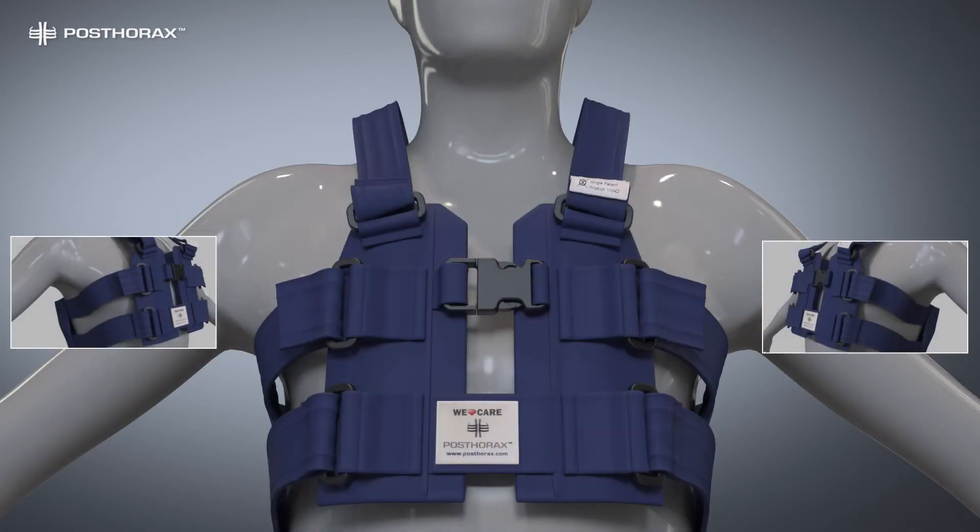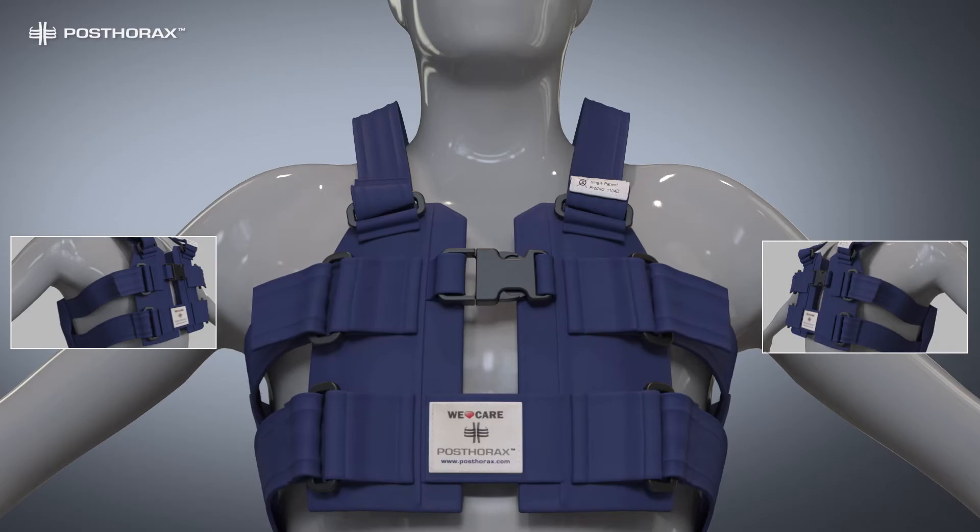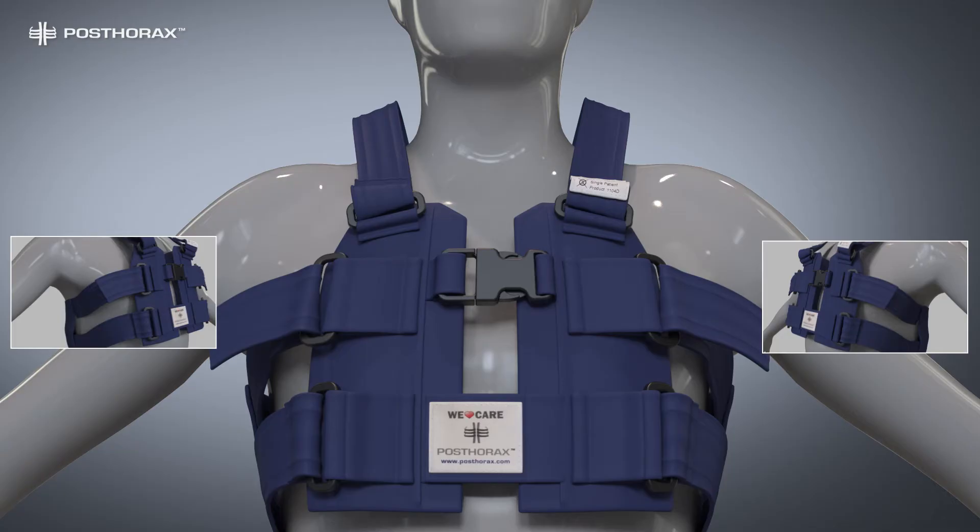Now open the upper side straps. While the patient is breathing in deeply, pull both straps equally tight to the widest expansion of the mechanics of breathing. Then close the velcro.